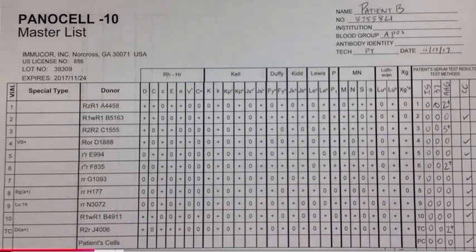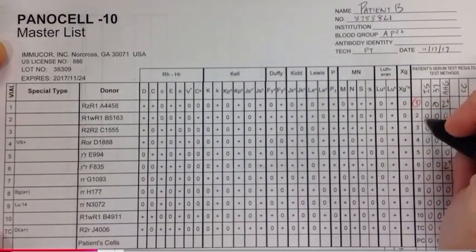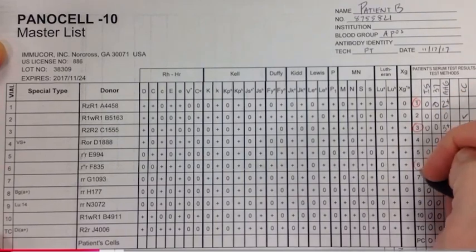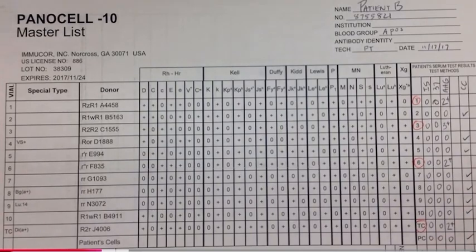Okay, so the first thing I'm going to do here is circle all of my positive vials or cells. So we have 1, 3, 6, and then TC, which stands for technical cells, and we're just going to treat that as the 11th vial, or sometimes I'll refer to it as these cells.